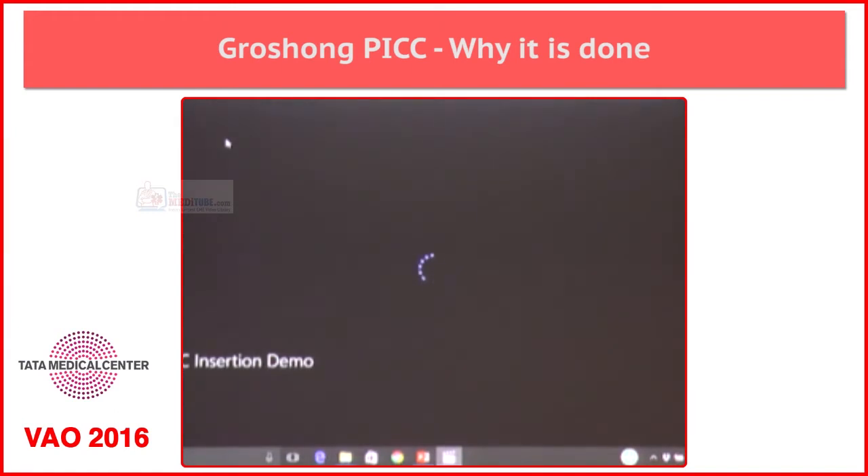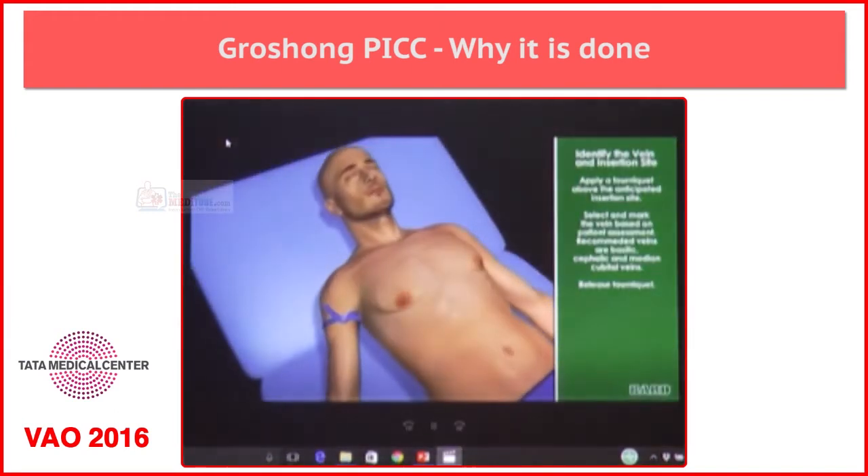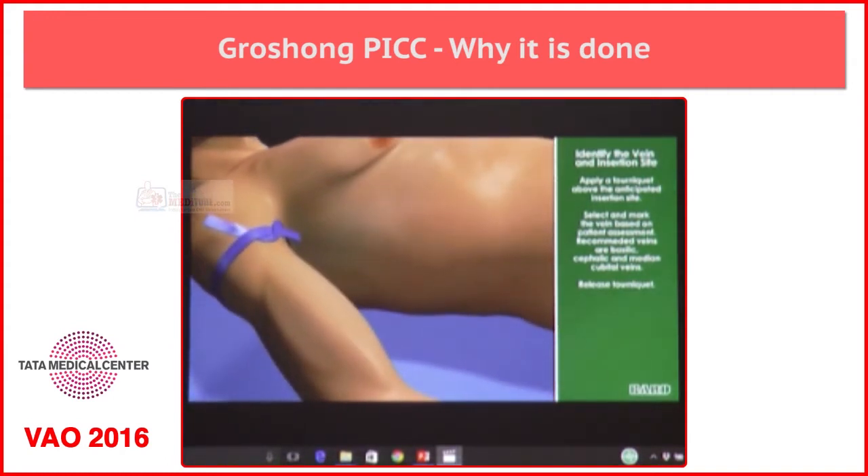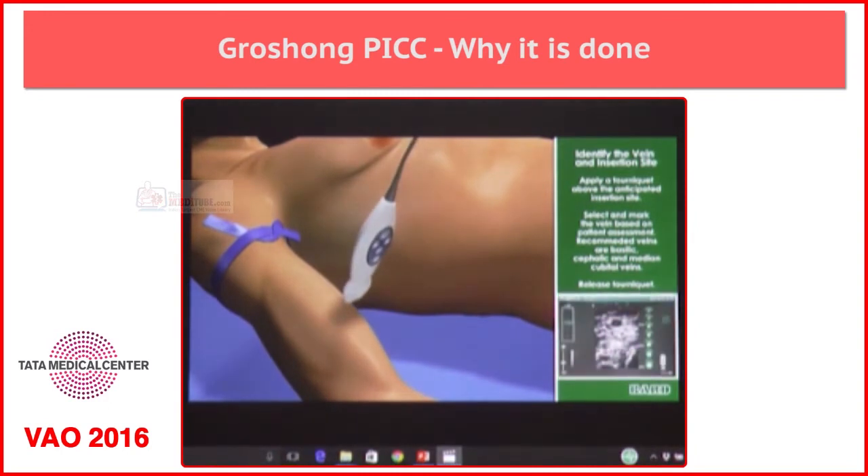This Power PICC is an animated video — this will give you a brief about what happens inside. So when we see the things outside, apart from that, what happens inside, you can also have a look at this.